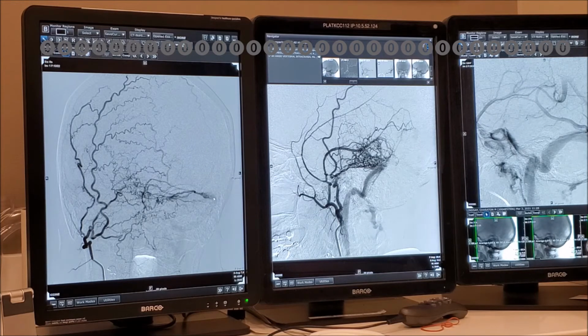So we did her treatment case on Monday, which is the next study, and went transarterial with Onyx, but then had a transvenous balloon up. You don't have to do transarterial. You just go trap that thing. This thing will all disappear. We wanted to preserve the sinus because she's relatively young, and we thought if we could embolize safely and preserve the normal flow through the sinus. But it's not existent. I think it's a simple thing to do.